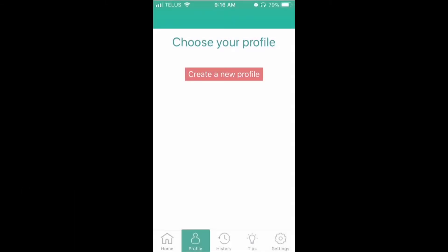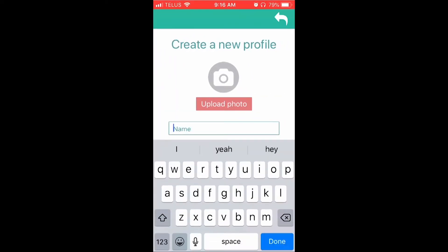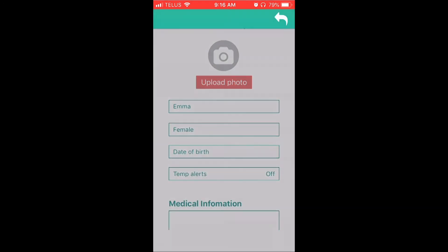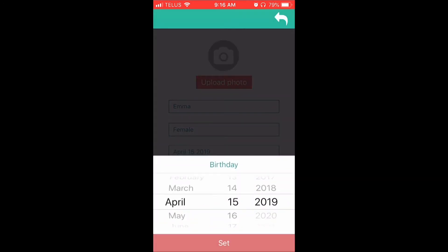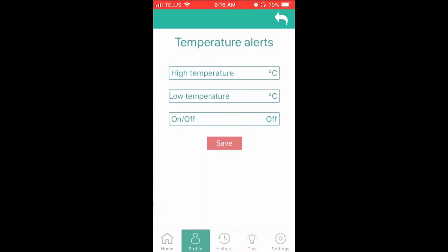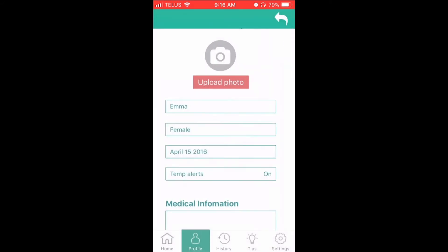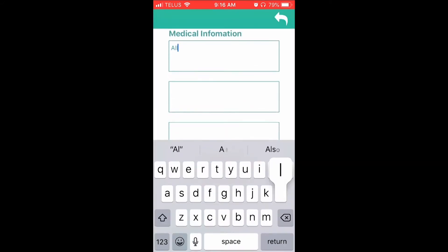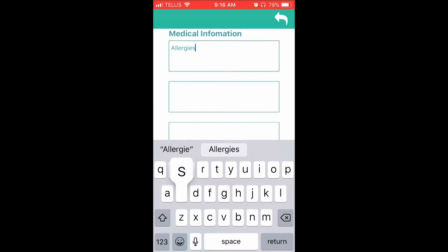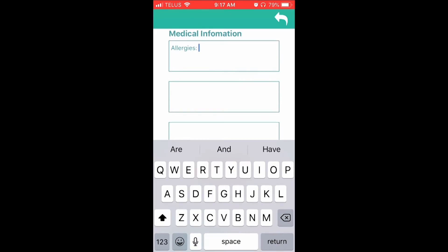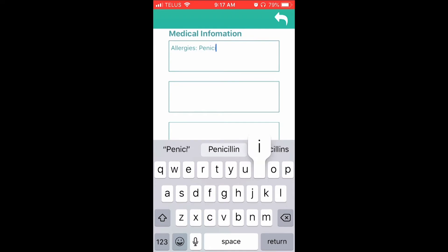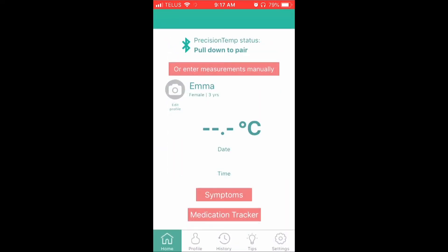Once you have registered, the app will prompt you to choose a profile. Here is where you will create each family member's profile. Click on the Create New Profile button. Enter the first family member's information as outlined on the screen. You can even upload a picture of that person. In the Medical Information section, you can list any important medical history. Once you hit the Save button, you will be taken to the Home screen, and the app will be ready to download the readings from the BIOS Precision Temp Bluetooth Ear Thermometer.